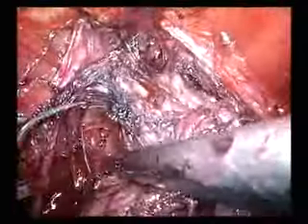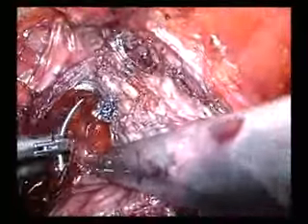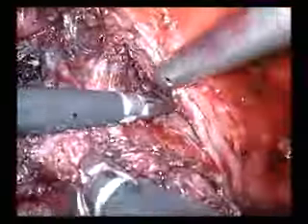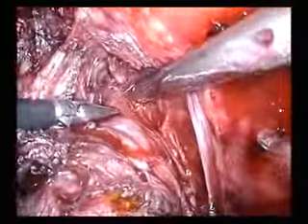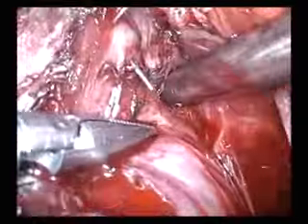After full mobilization of the apex of the prostate, the Santorini plexus is ligated. A 2.0 Polysorb GS22 slightly straightened needle is used and guided from left to right in the plane below the dorsal venous complex, and the plexus is thus ligated.